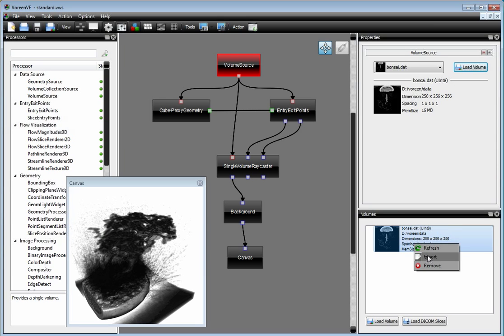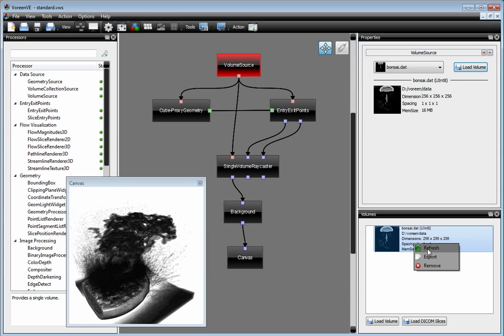And we can export this one. That's handy when you have loaded a DICOM dataset which you would like to convert to raw data, or you could refresh this one if you have modified it with an external application.